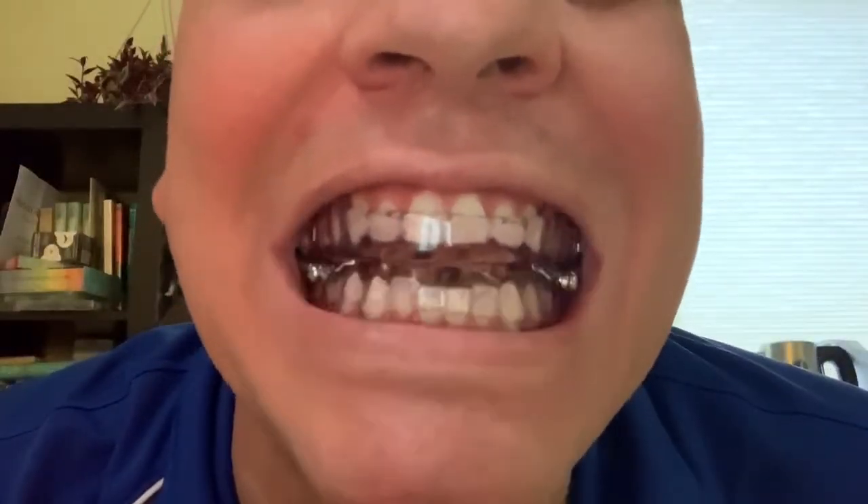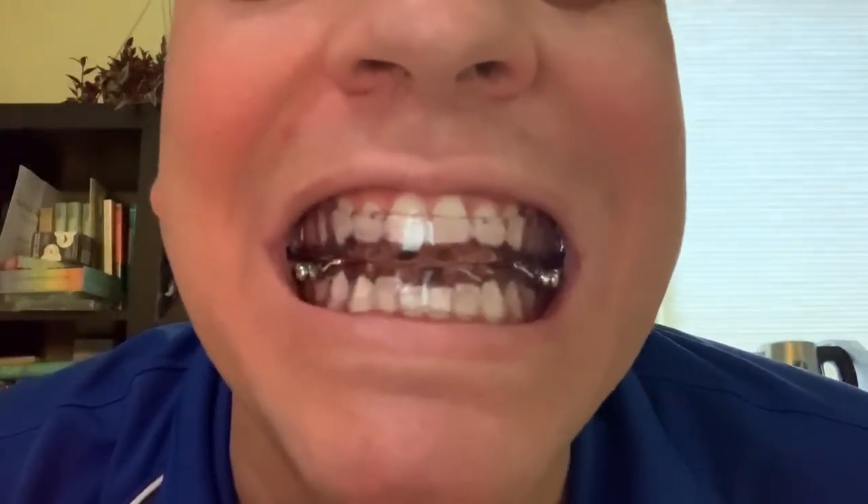So we're going to go ahead and try this in and see how it fits. There we go. First time putting it in my mouth, just like all my Somnomed devices — first fit every single time. Good job.